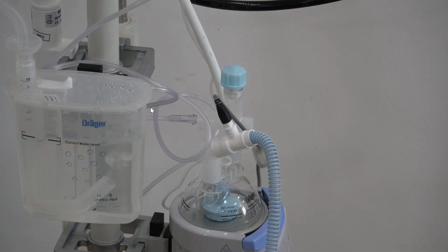Okay, so the next question: can you explain the difference between CPAP and PEEP? Linda, would you like to do that, or shall I say a few words about it? So I will start and you can take over. So CPAP is continuous positive airway pressure. So that's to keep the lung open.